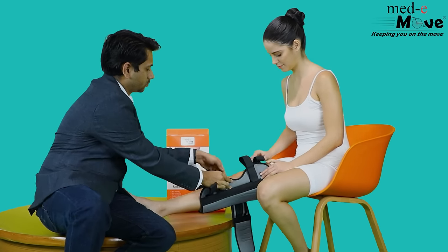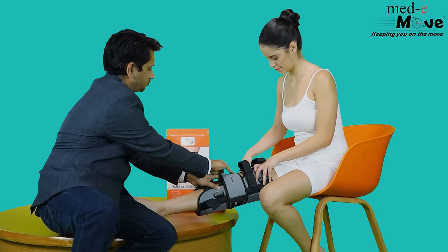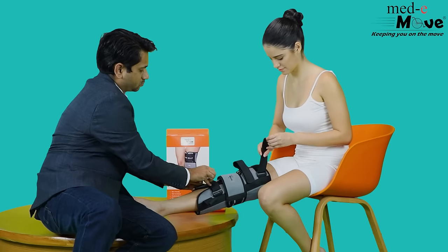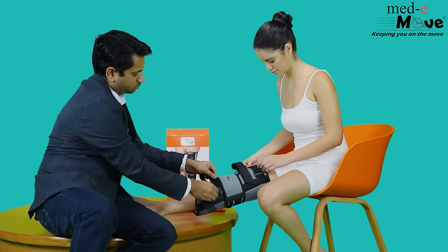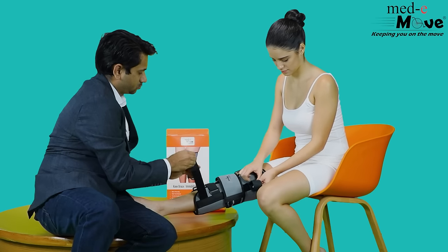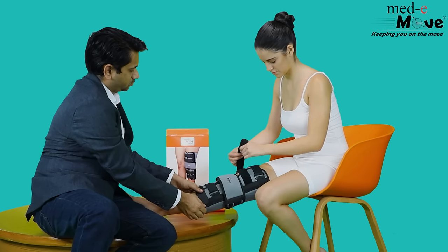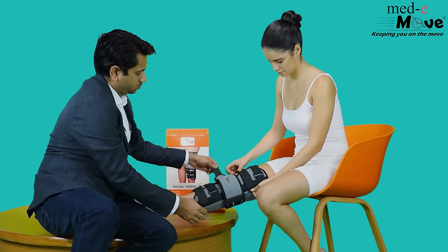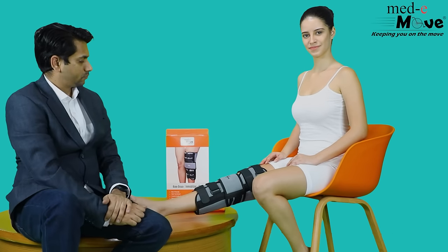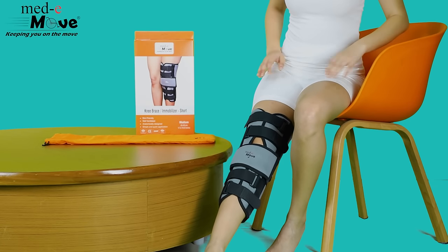Now gently fasten all the hook and loop closures. Make sure the grip is firm so that the knee doesn't bend, hence immobilizing the knee.